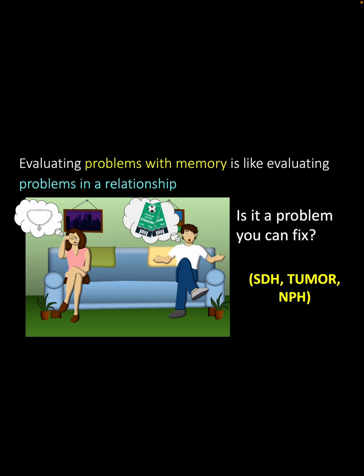Now, while they might love for us to give them an exact answer, oftentimes we can't. And they know that. So instead, what they're looking for is for us to answer a very important question for them. Is there some action that they can take to help this patient with cognitive decline?